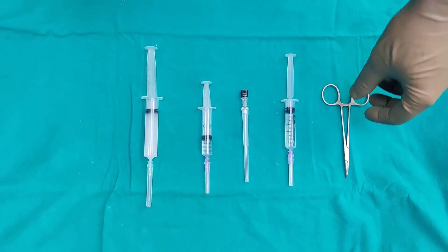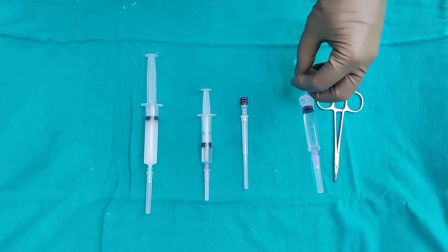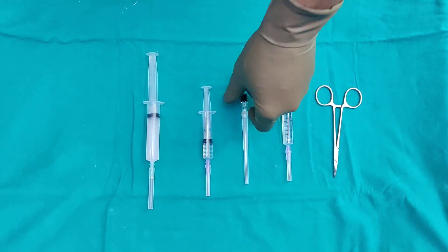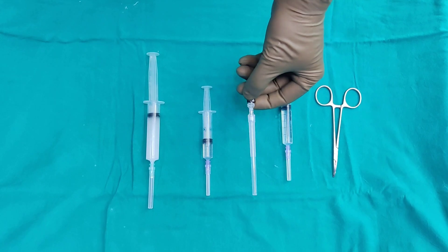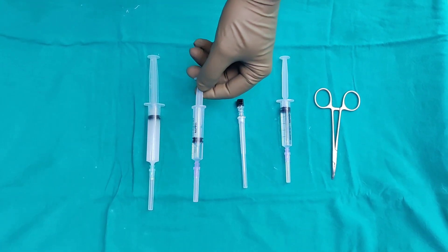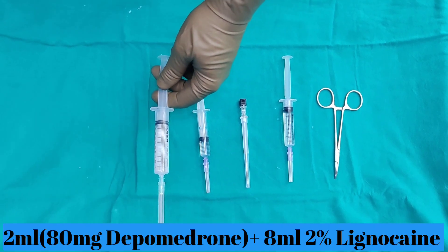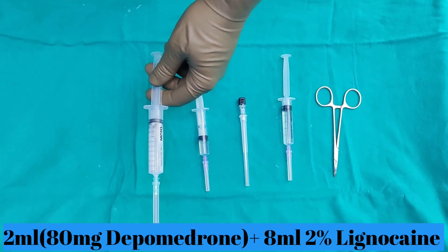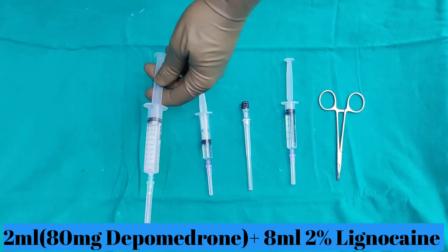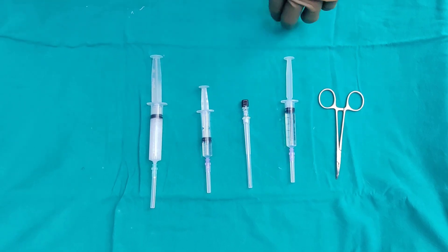For this particular procedure we have a mosquito clamp to localize our area of interest, some local anesthetic to make the procedure as pain-free as possible, and a 22-gauge spinal needle. We also have Omnipaque dye to confirm our position, and 10 ml of injectate which is a mixture of 80 milligrams of depomedrone — 2 ml — and 8 ml of 2% lignocaine. This is what you will need for this procedure.